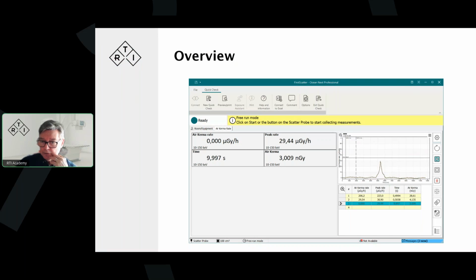There we go. Here we had a bit of a question: dose with distance ratio or equation. I don't really understand the question, but what we're doing with the air kerma and with the values that we're showing is at the point of the detector. So we need to factor that in as well. Distance changes the measured radiation, of course. If we move away, we'll measure less radiation.